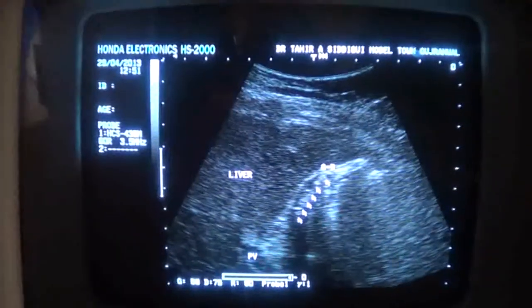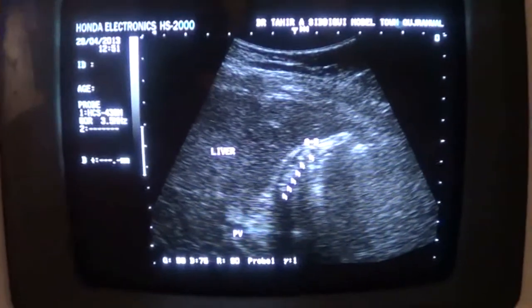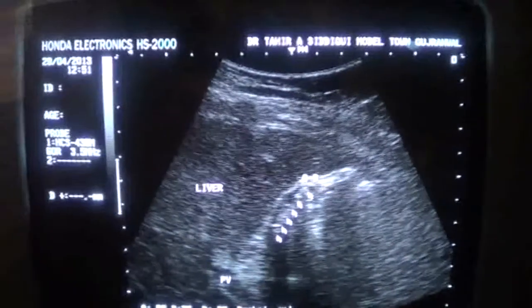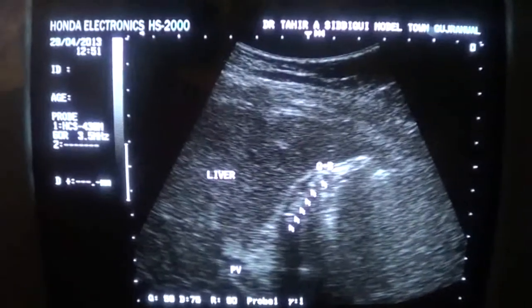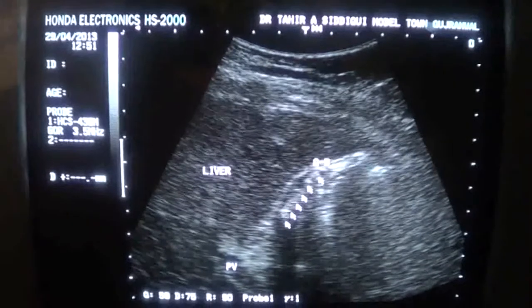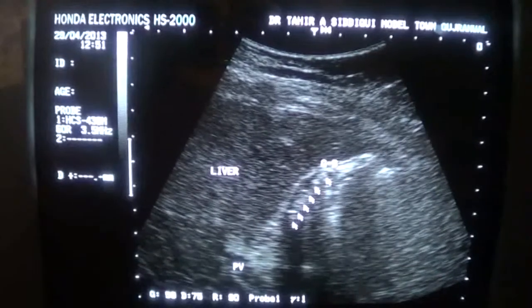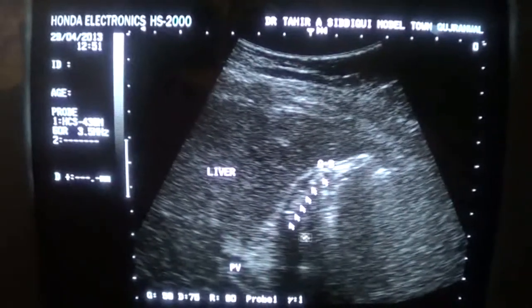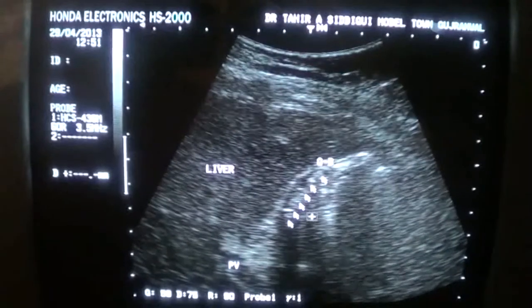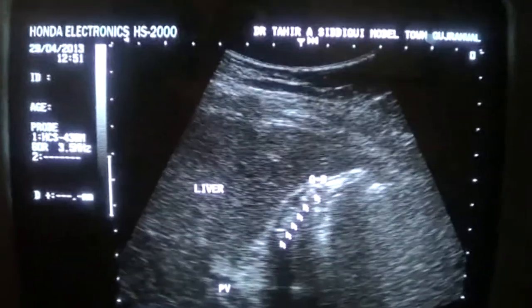This is a contracted gallbladder. In front, on the view, you are seeing that this is the anterior wall of the gallbladder. The posterior wall is not seen, because we see multiple echogenic particles within the lumen of the gallbladder. These are tiny calcified areas giving posterior shadowing. The intensity of the shadow is enough to obliterate or hide the posterior wall of the gallbladder. This is the case of cholelithiasis in a contracted gallbladder.